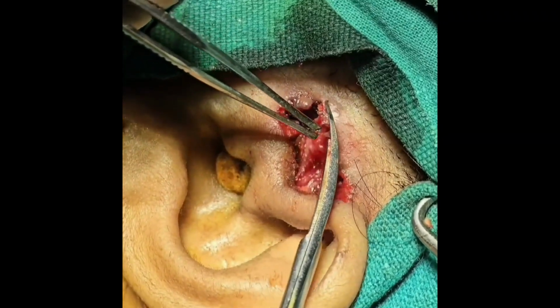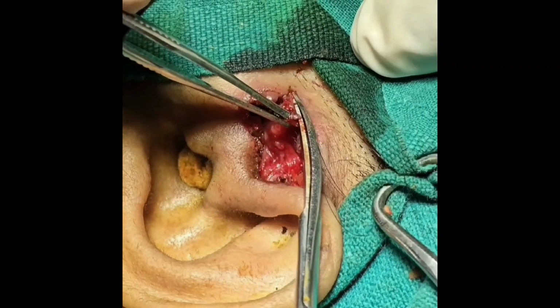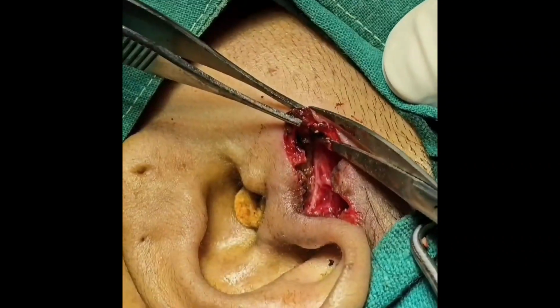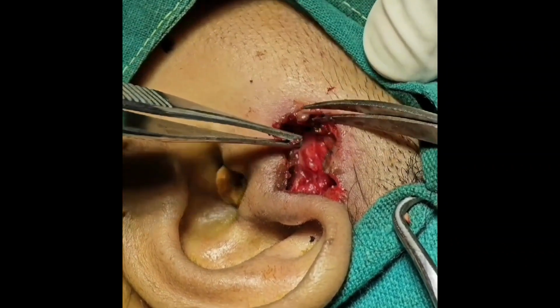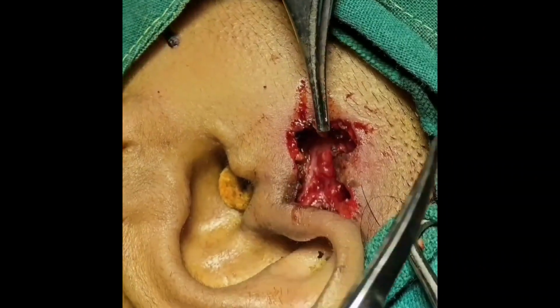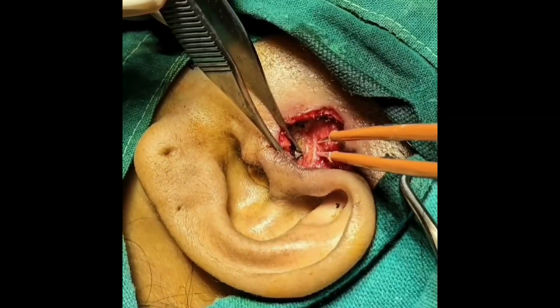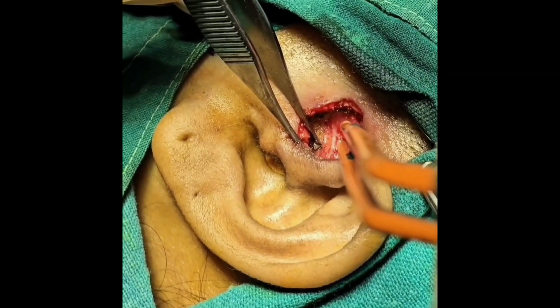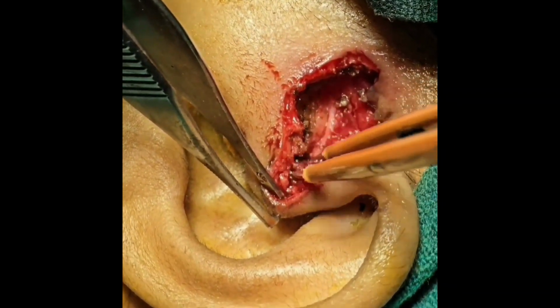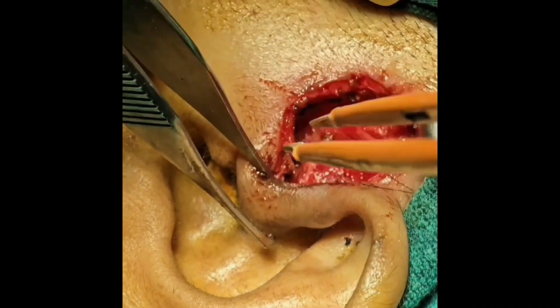Now I have put some betadine and am just trimming the irregular skin edges at the site of the previous abscess. Also some skin might need to be released to get a good apposition. We can put mattress sutures if there is a big skin defect. Otherwise, the skin is usually very lax here, so normally we can approximate them without any problem, even though we have sacrificed a bit of the skin.